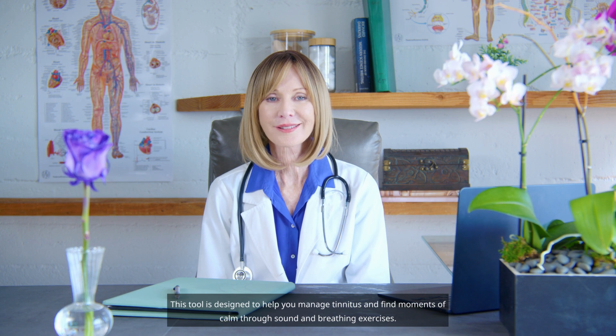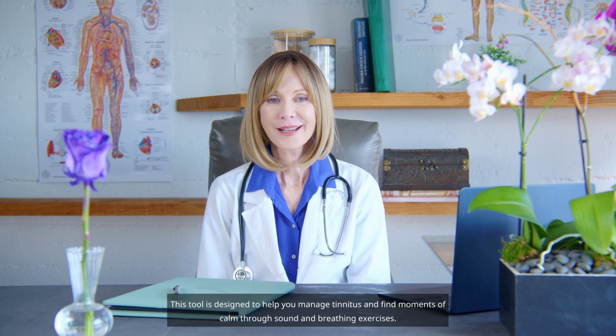Welcome to our how-to video for the Tinnitus Live Therapy and Sound Masking app. This tool is designed to help you manage tinnitus and find moments of calm through sound and breathing exercises.